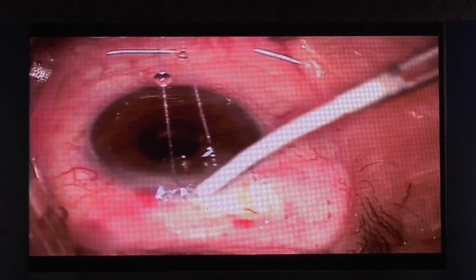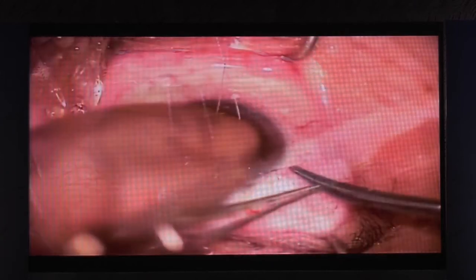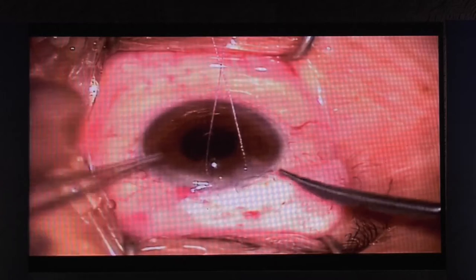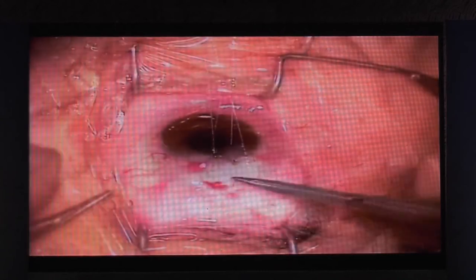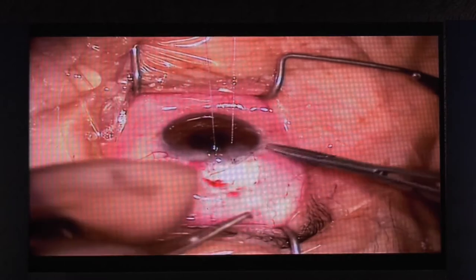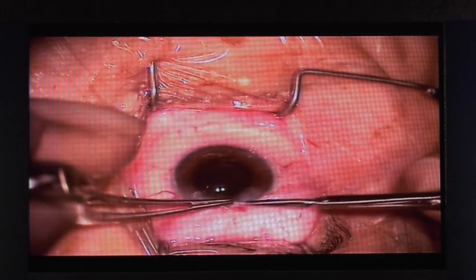So they tested the eye, and they realized that the anterior chamber is shallowing too fast. And you can see there's a leak there. In this case, luckily, it was a small tear, so they could actually primarily repair it with a box suture using a 10-0 nylon suture. So you don't want to put one stitch across, you want to put a box stitch across so that you can spread out the tension. And then, of course, you can stitch the anterior aspect of the flap so that you direct the flow of aqueous posteriorly through the flap. And then you do a good closure of the conjunctiva, of course.